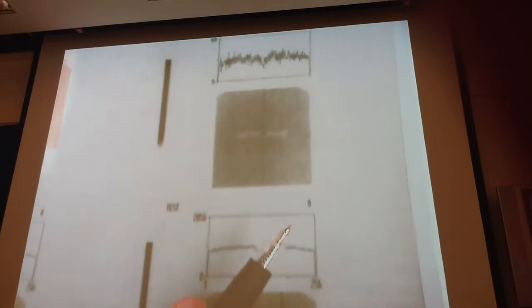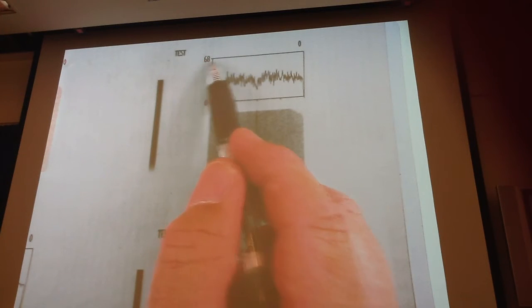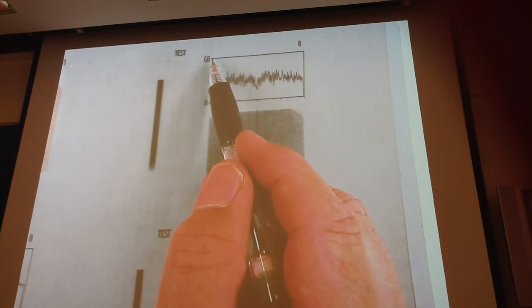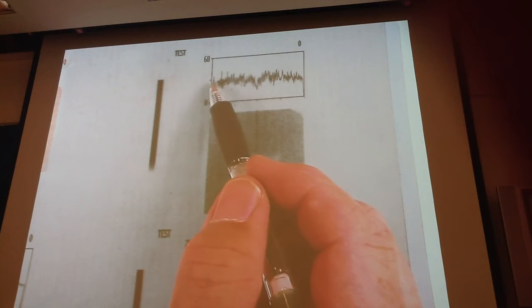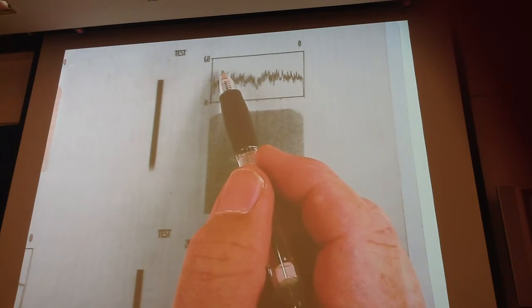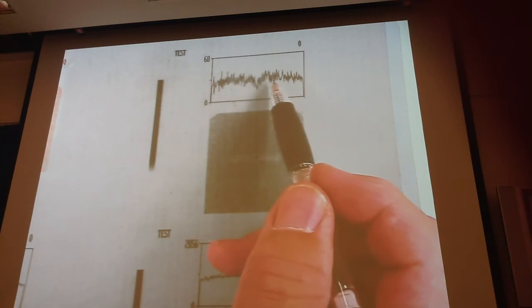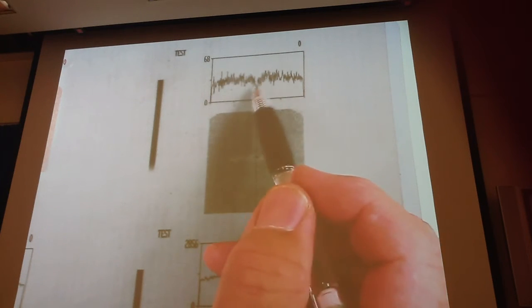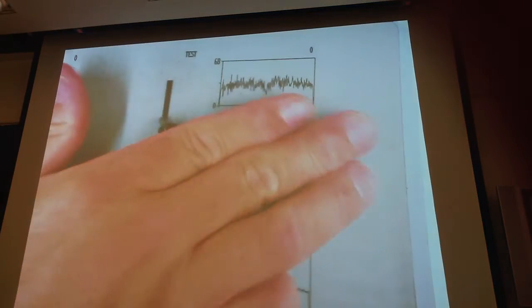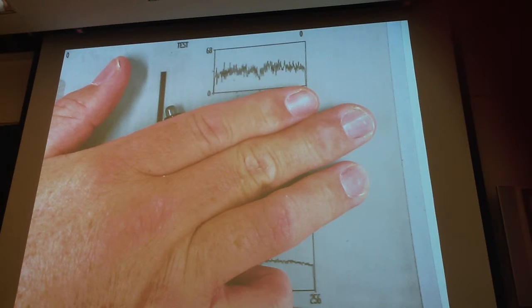So if I was to subject this to a low pass, now this tells me the maximum number of counts. Okay, 68. So that means that most of these counts are somewhere between maybe 5 to 30 per pixel. Can you even see the object? If this thing wasn't here, could you see that there was an object there? You see that there's a decrease there, so maybe there's something there.